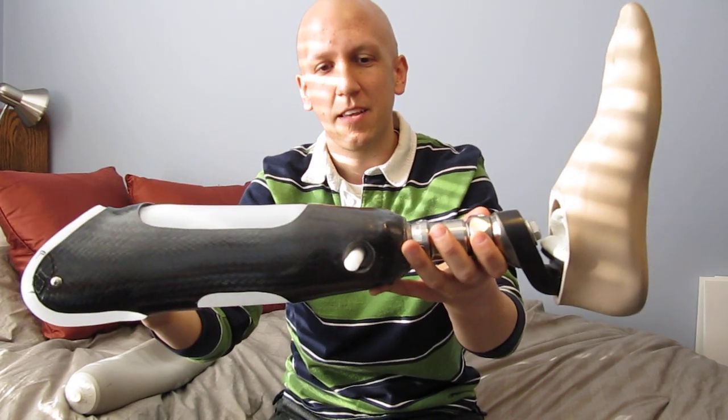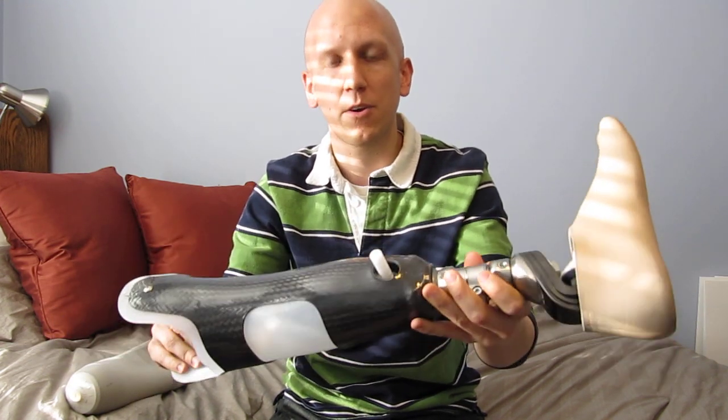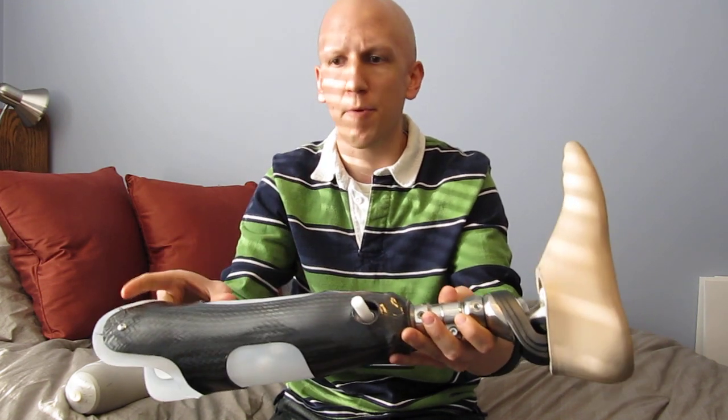Hi! Today I got a new leg. I posted pictures of some of my previous legs, but in this video I thought it would be cool to show some of the technology of how this leg works. It's pretty impressive.